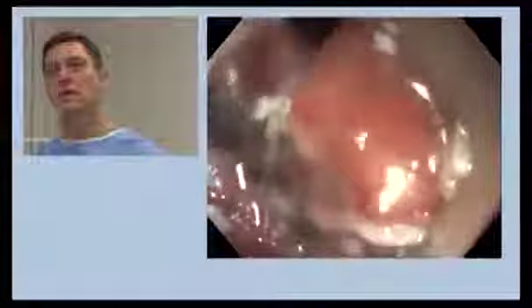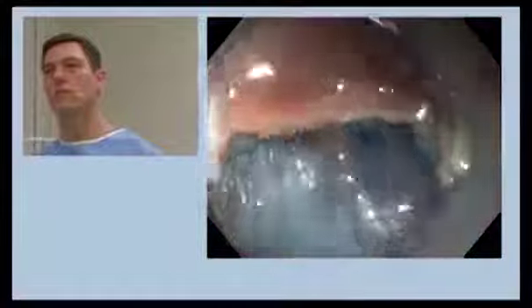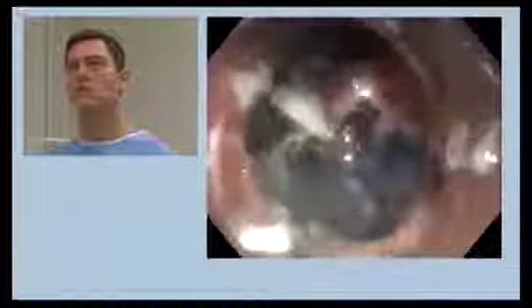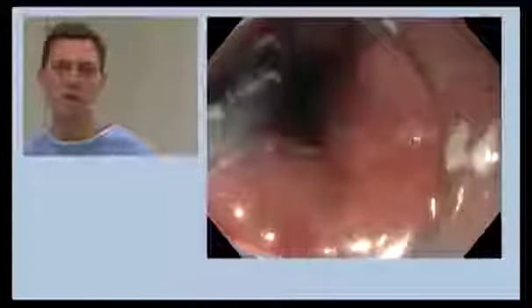So of course we're going to do it exactly as advised. We're over the muscularis layer everywhere here, I think. And we'll soon have cut round it completely. There's one small piece left here. And then I think we're all quite happy and relaxed. And from here at the top, where we still have a clear submucosal layer, we can dissect downwards into it, where it gets trickier again. And we'll take the neoplasia and the Barrett's out of the scar. There's not much left separating us from a complete incision round it.